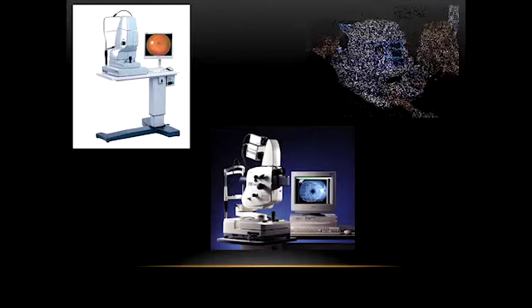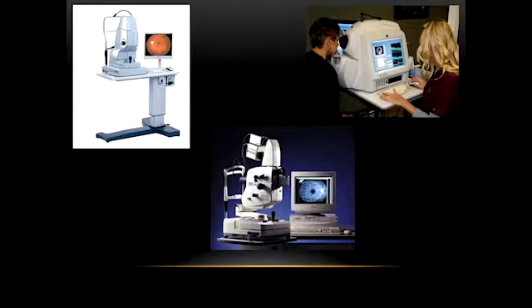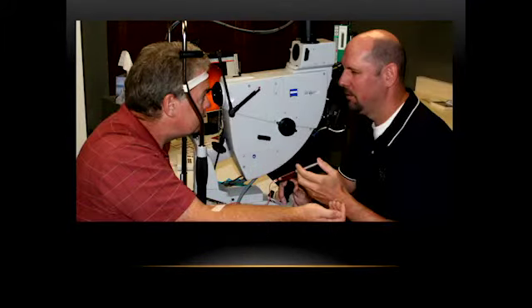The equipment necessary to perform these imaging tests has evolved significantly over just the past few years. This allows for detection of amazing detail. Modern imaging systems and their software are also more patient-friendly than ever before, mainly in terms of speed. Well, a fluorescein angiogram is the gold standard test for evaluating the status of blood vessels in and under the retina. This test still requires a highly skilled technician to capture timed images following dye injection. Let's sit in on an actual fluorescein study.